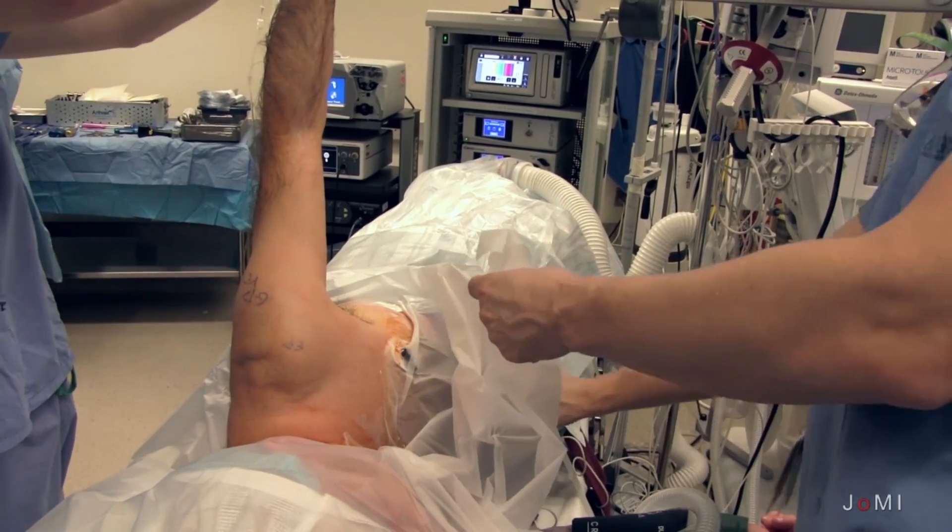After that is performed, they then come back to the operating room where they undergo a light general anesthetic. After the light general anesthetic is obtained and all the lines are secured for the patient, we place the patient in the lateral decubitus position.